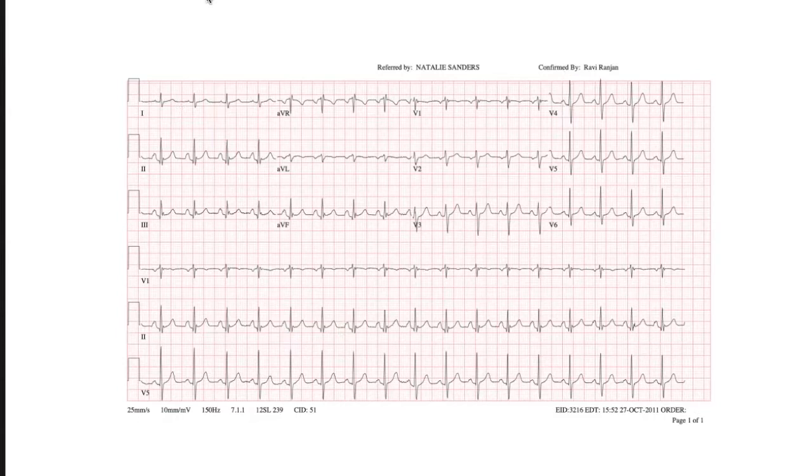Okay, who hasn't calculated heart rate for me? I think Ben has. So Ben, go ahead and calculate that heart rate. It's going to be 120. I'm counting 3 boxes. And if we're saying 6 is 60, then double. 5 is, oh whoops, 6 is, or wait, 6 would be 50, though. It's 100. Yeah, there you go. Clever technique, though. So is this slow, fast, normal? Fast-ish. We'll go with fast-ish.